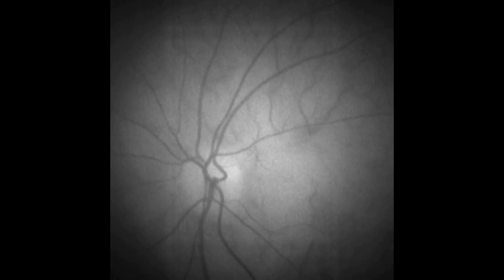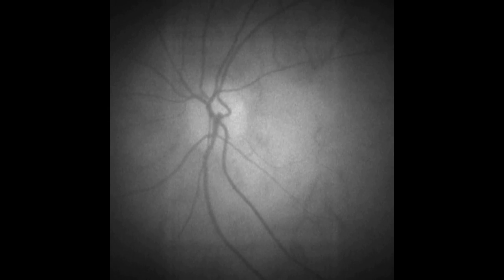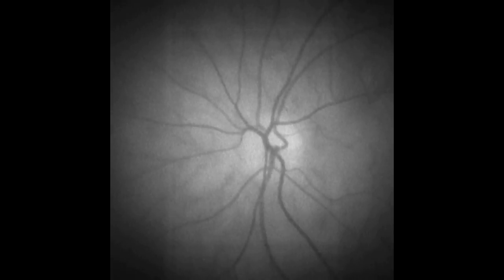Here you can see the video footage that can currently be computed in real time with commodity computer hardware and a streaming camera at a sampling rate of 2000 frames per second. Yet the variations of blood flow during cardiac cycles are difficult to spot.